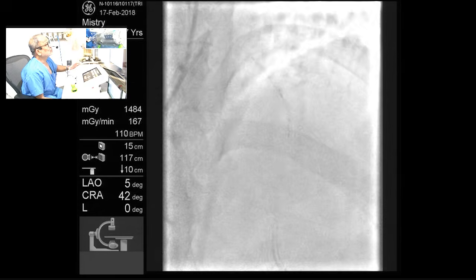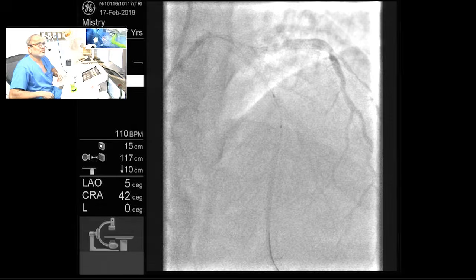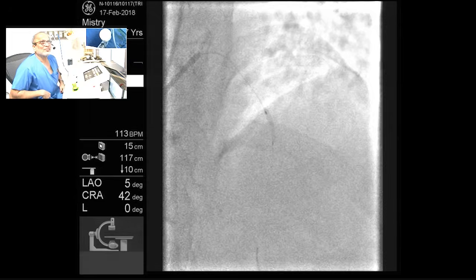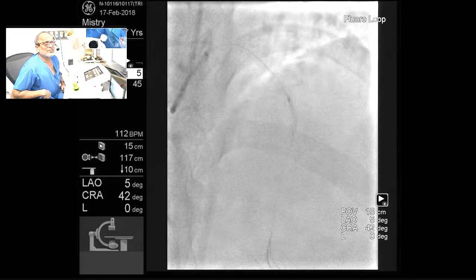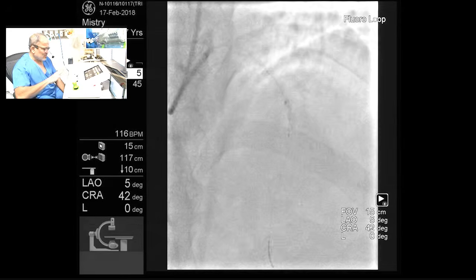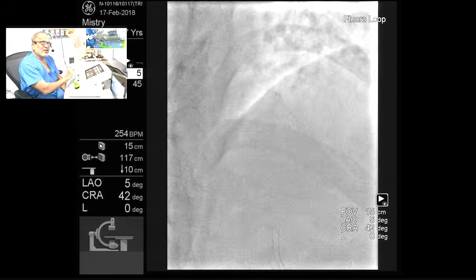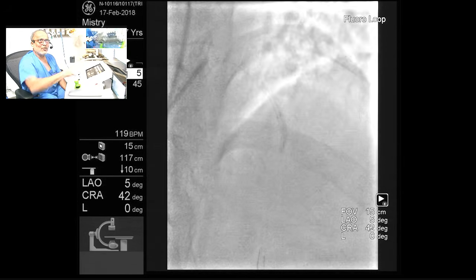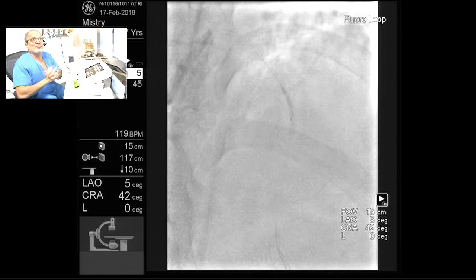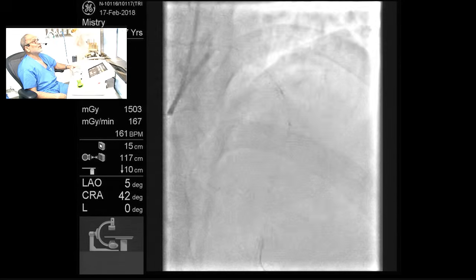Directly. Scout. Yes, record, go up 10, 11, 12. So how precisely can we rotate? That's what we are trying to establish. Because sometimes, if there are more angles in the coronary, I rotate only one side. It doesn't follow clockwise, counterclockwise. If it is a straight segment, it follows clockwise, counterclockwise. So we are trying to figure out those things. Deflect. Deflect. Go, scout.